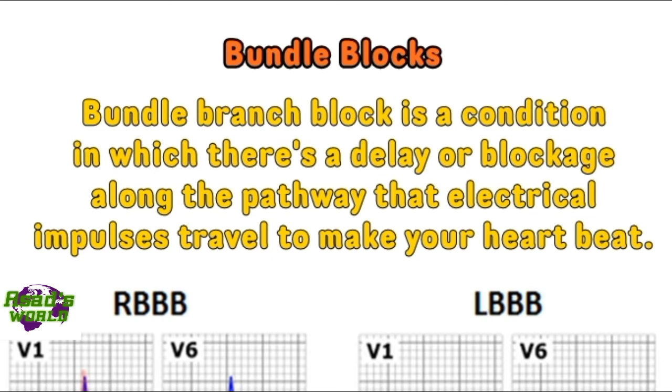So bundle blocks, talking about the last topic of this video. Bundle block is a condition in which there is a delay or blockage along the pathway that electrical impulses travel to make our heartbeat. Now it has two types: right bundle branch block or left bundle branch block.